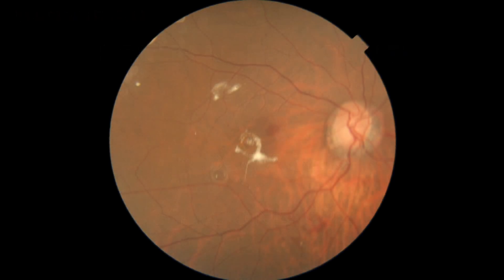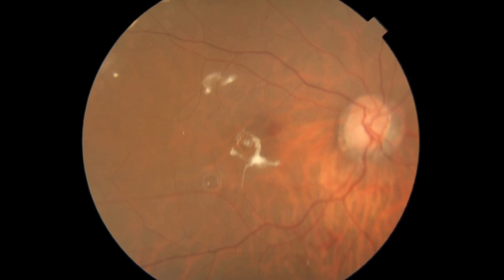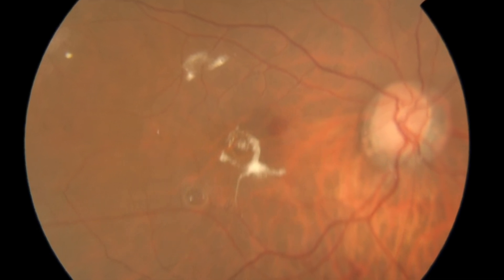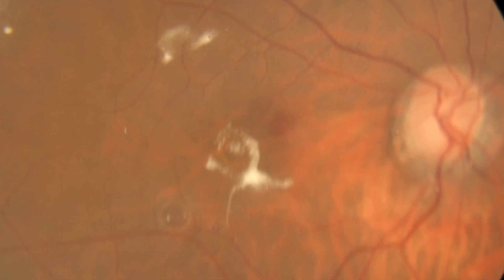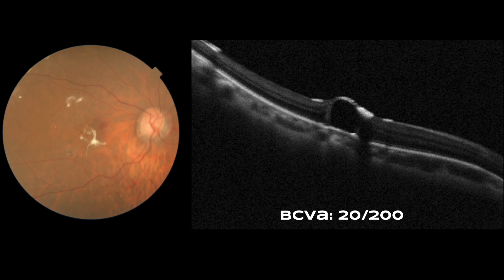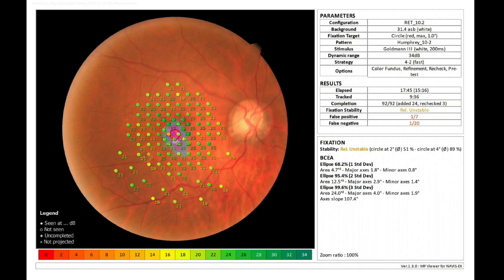The procedure successfully reattached the retina. However, in the early postoperative period, two subretinal perfluorocarbon bubbles were visible — one subfoveal and the other in the inferior temporal parafoveal region. Visual acuity measured at this time was 20/200. Microperimetry showed reduced sensitivity in the foveal region.